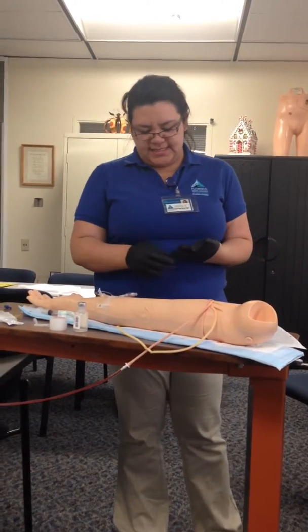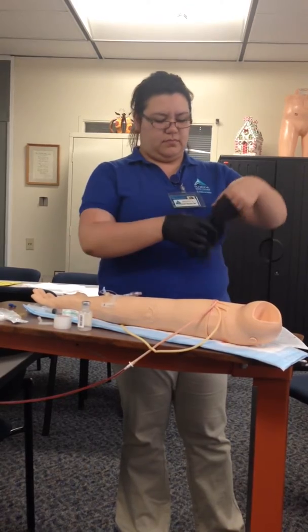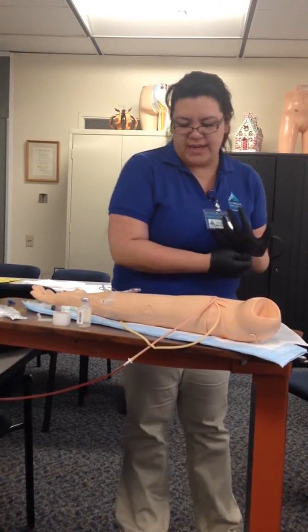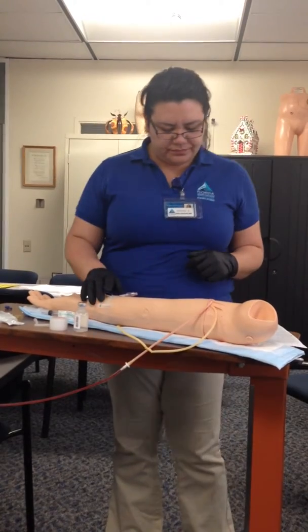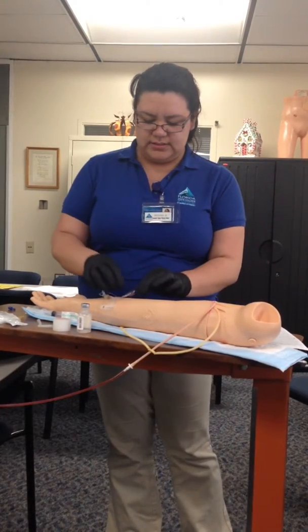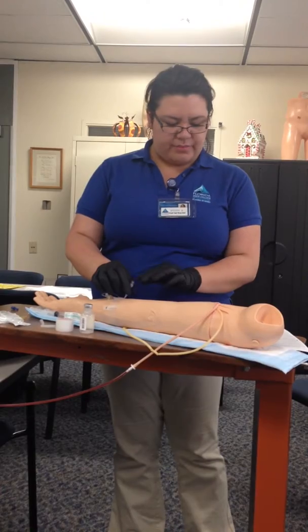So I'm just going to assess the site of the IV. Just make sure that there's no redness, pain, swelling, infiltration, edema. And I'm going to begin the ASASH procedure, which is to aspirate, saline, administer, saline, and then heparin.